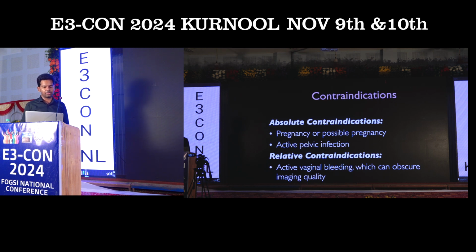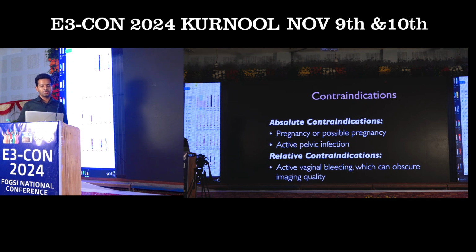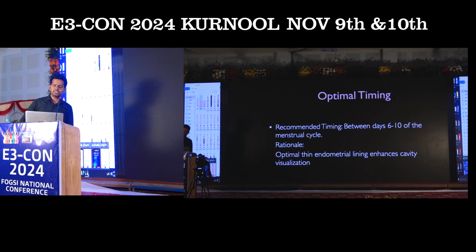Contraindications: pregnancy, and active pelvic infection which can worsen the present clinical condition, are the absolute contraindications. Relative contraindications include active vaginal bleeding, which can obscure the imaging quality. The optimal timing is the 6th to 10th day.